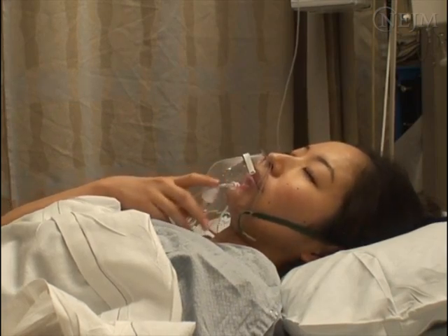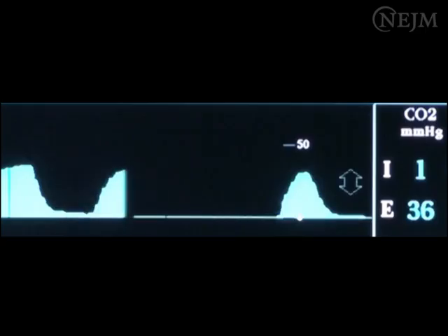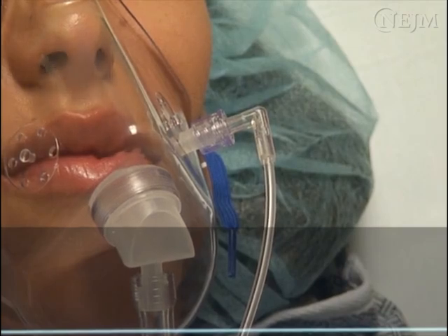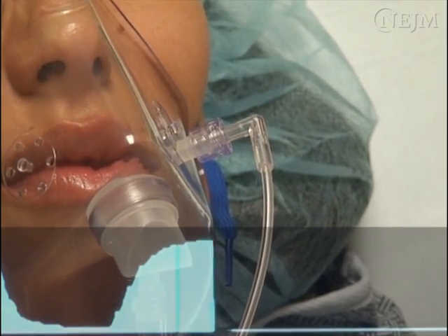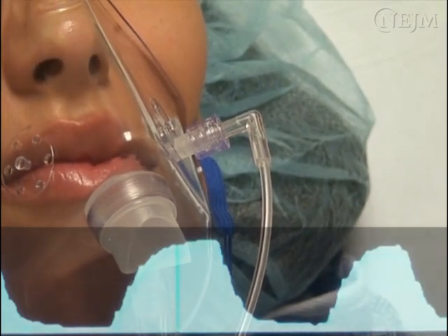As the side-stream catheter is moved farther away from the patient's airway, the EtCO2 value will decrease progressively. Although the EtCO2 of a patient who is not intubated represents only a qualitative indicator of ventilatory status, the patient's respiratory rate can still be determined from the waveform of the capnogram.